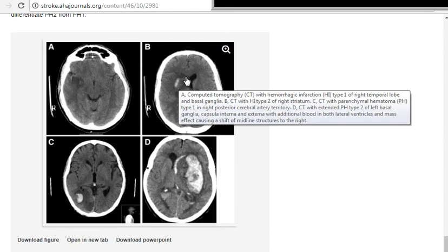It's hard to argue because some is mass effect from the stroke; we attribute all the mass effect to the stroke and not much to this particular hemorrhage. And then type 3 is a smaller hematoma, basically less than 30% of the stroke volume. What is a stroke volume? I guess you have to estimate it, use your mental calculation.